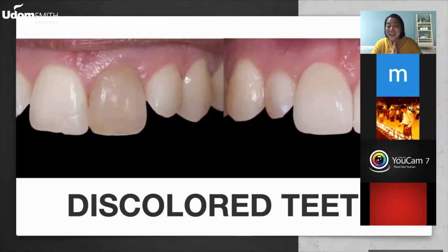And he is my co-host, and he has a relapse after braces, in orthodontic treatment. He doesn't want to go through another orthodontic treatment. But before we corrected his bite, I did a whitening on him. And that is why the natural tooth looks so nice when the Edelweiss was placed, because Edelweiss is translucent.